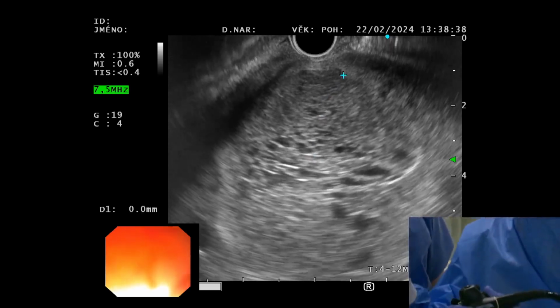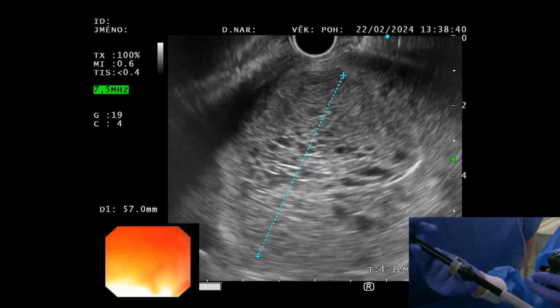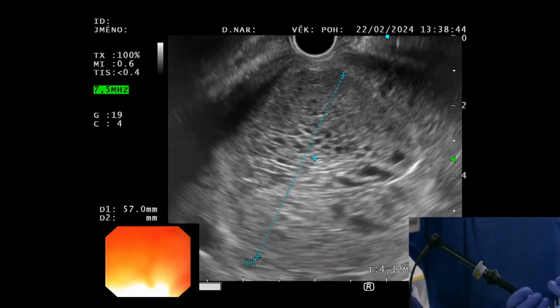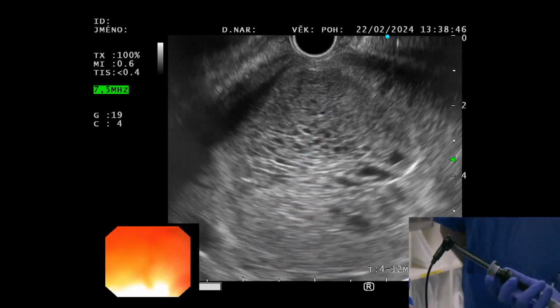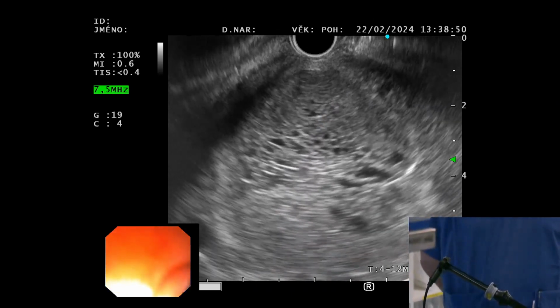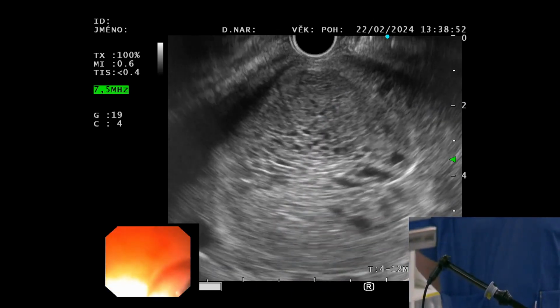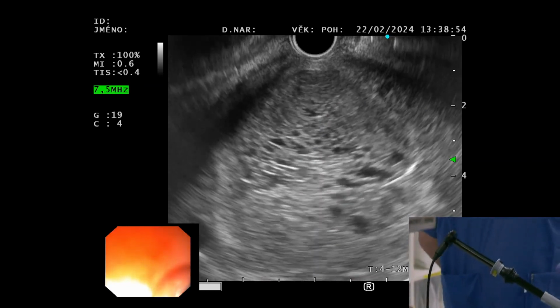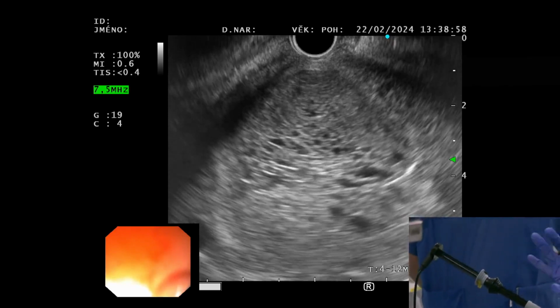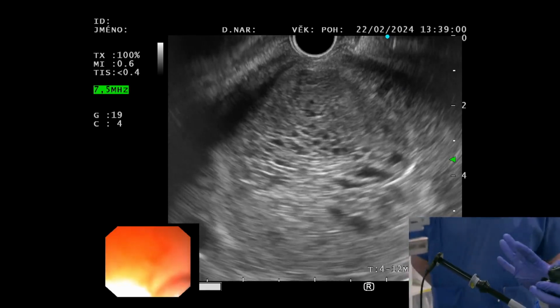Now I'm ready to make it hot. So now Hannah is going to attach the cable. We are hot now. So we're energized. Okay, and now I'm ready. So I'm going to step on the yellow pedal. I have my settings, which are auto cut or pure cut, effect 5, 100 watts. Those are the standard settings.